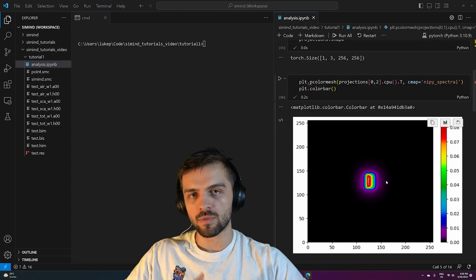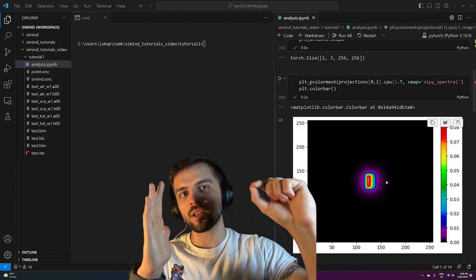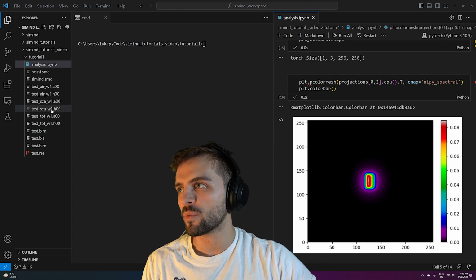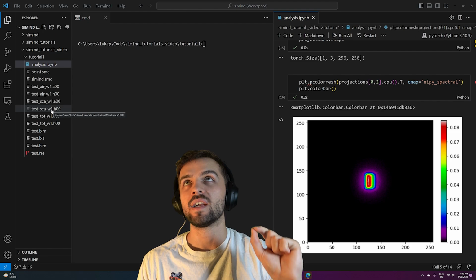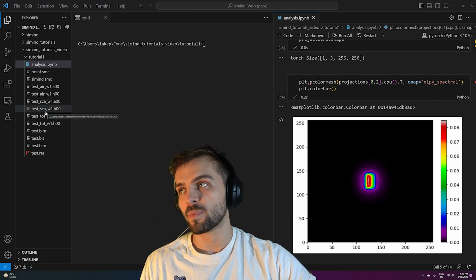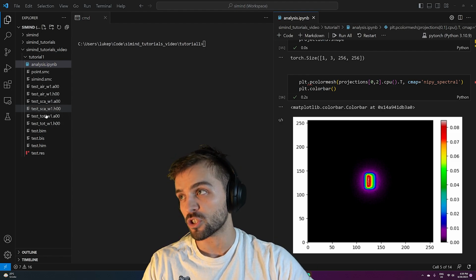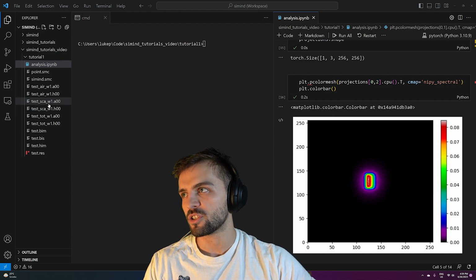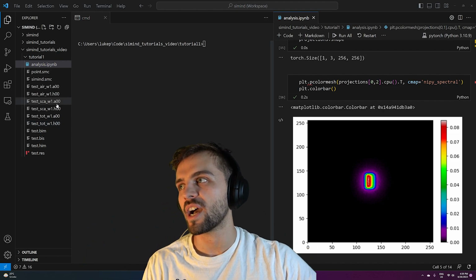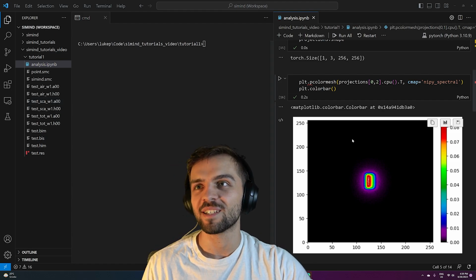So this is what's known as scattered events. And so the total events, when you just take a SPECT scan, is going to include the ones that really are coming in like this, and then ones that occasionally go in another direction and scatter and get detected. And so that's what the scatter is for. So these scatter windows contain only photons that have scattered and then been detected. And in reality, when you take an actual SPECT scan, you do not know the ones that have scattered versus the total. You only have access to the total. Now, the advantage of the Monte Carlo simulation is you can separate the scattered from the total because, of course, it's simulated, and when you track the photons, you know which scattered, but in real life, you don't have access to this scattered window. It would be very helpful if we did, but we don't.